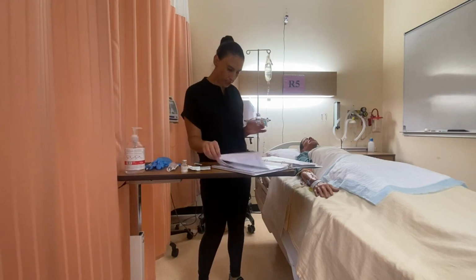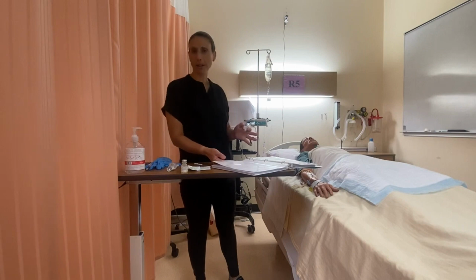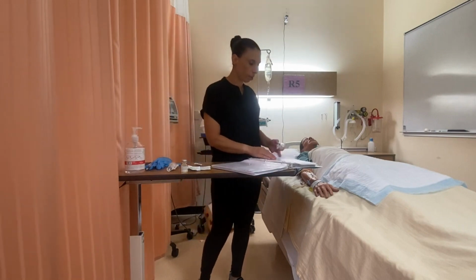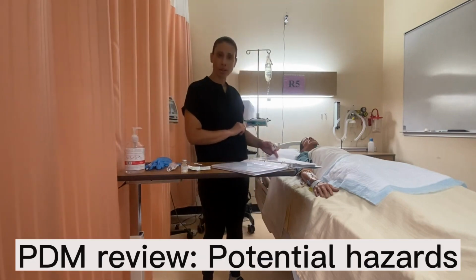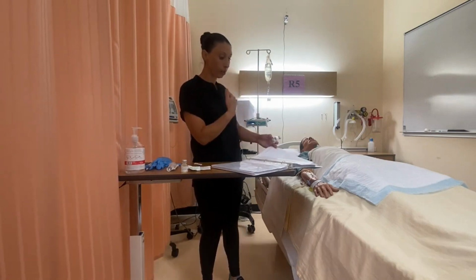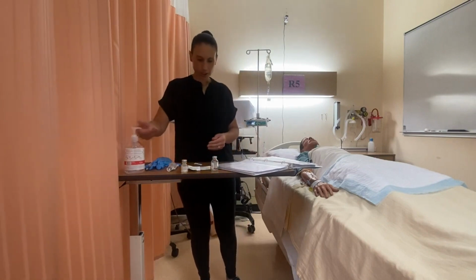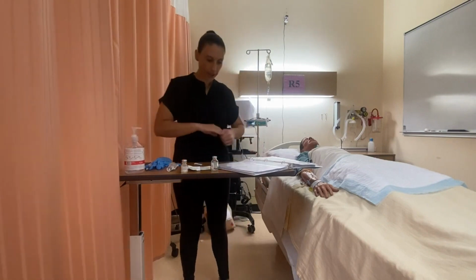The other things I can take a look at as well, compatibility isn't a concern because there's no running infusion. The patient has a peripheral IV lock. I could also take a look at the potential hazards as well, so for my patient education and also as well as informing myself of what to be aware of. All right, so I'll do my hand hygiene. Okay, I did my first check.